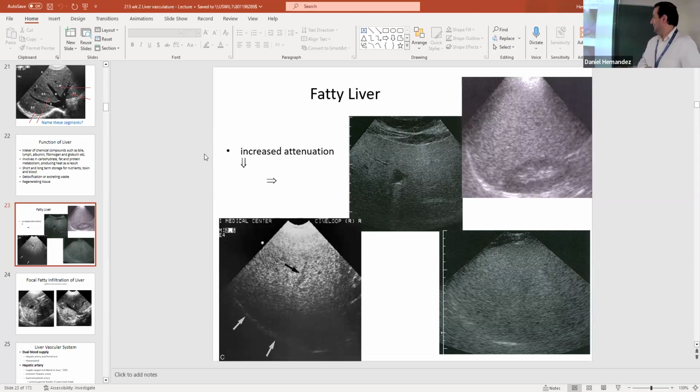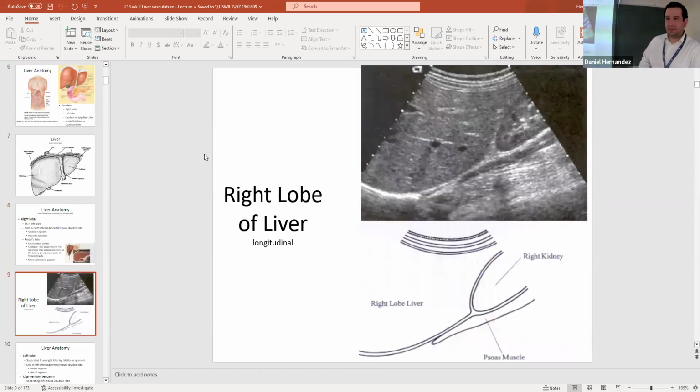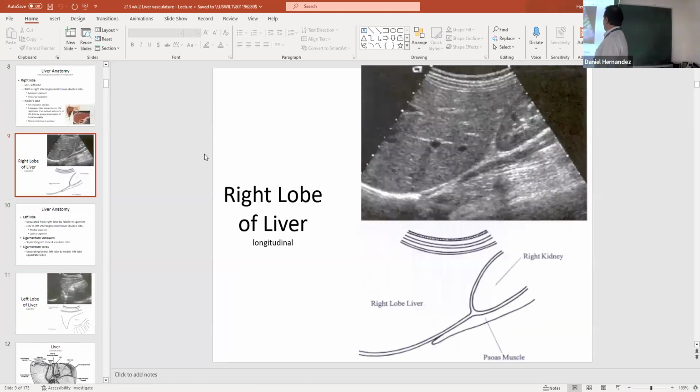That one in the corner, you can't even see the kidney. That's usually when you know, because it's hard. No, that was normal. This one's normal, where you go. There we go. So yeah, this is normal. It's fairly isoechoic. I mean, the kidney will look very, very dark in comparison, and this will get much, much brighter.